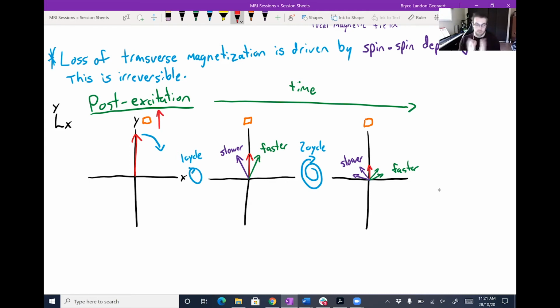And then at point 2 here, that NMV is already going to be a fair amount smaller, just because we're adding up the components that are in this direction towards the receiver, right? If we add up just those components, we're losing some of that magnitude because these vectors have components in the lateral directions as well. And then same thing at time number 3 here, this NMV is going to be even smaller, and this happens quite quickly, right?